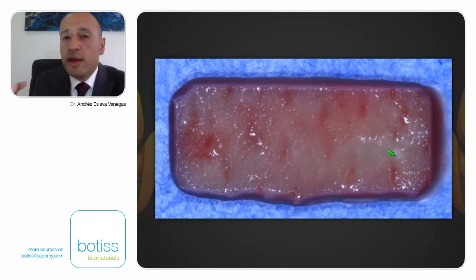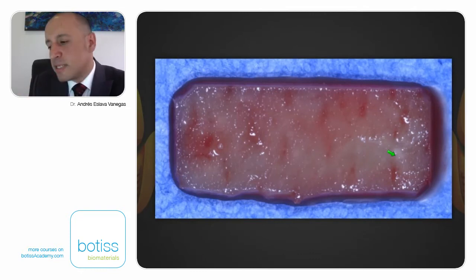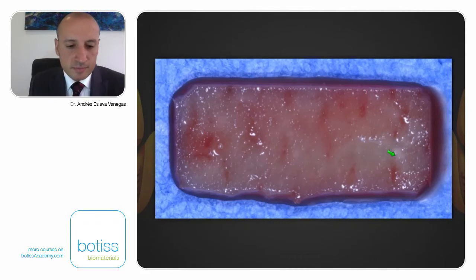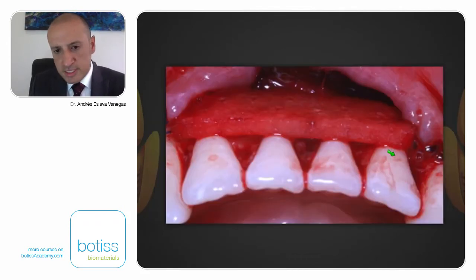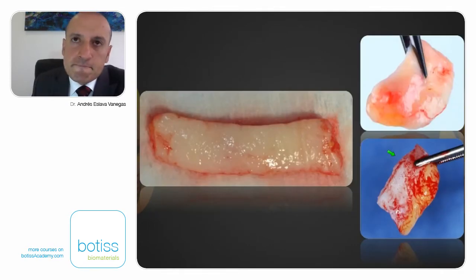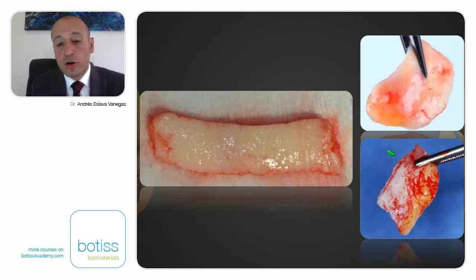When you put the membrane or the graft into saline solution, or into growth factors, it's going to be easier to handle, as you can see here, and it adapts well to the defect. If you take connective tissue grafts, and I'm sure you have taken a lot of tissue grafts, you can take them like this, but in some parts of this connective tissue graft, there is a lot of fat tissue and glandular tissue, and sometimes it's not as regular as we want.